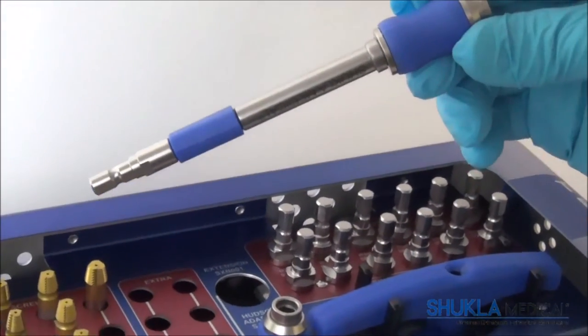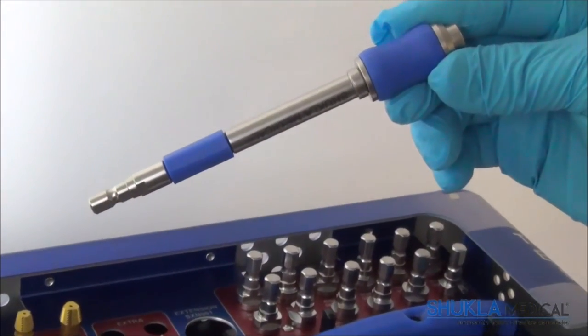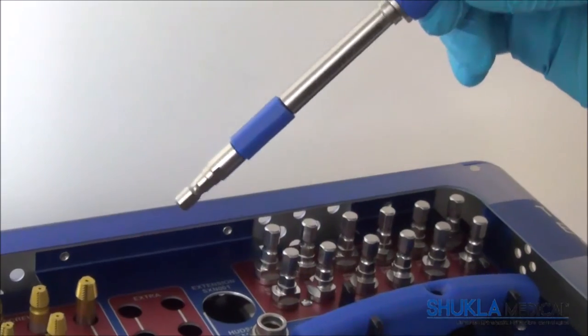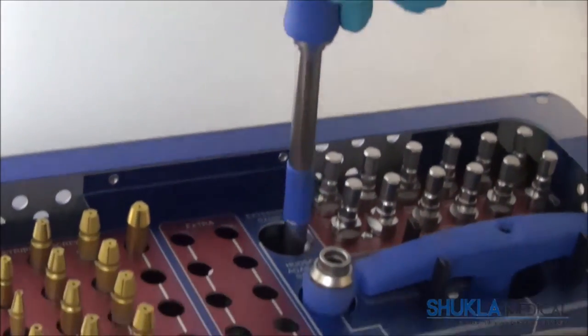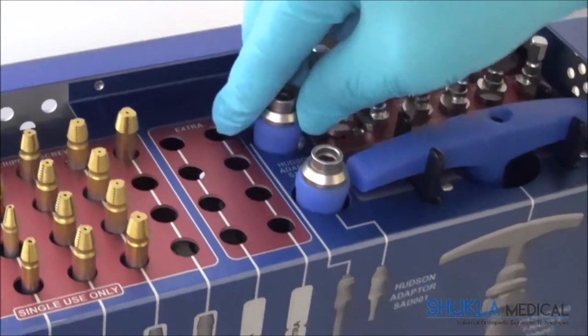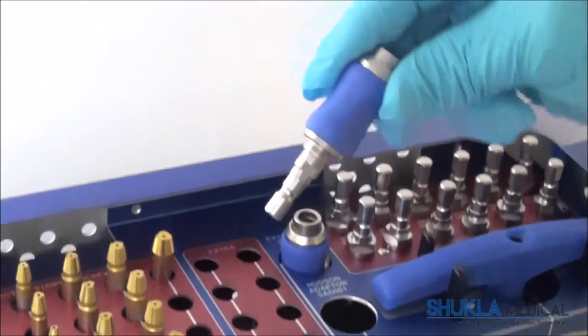To the right of the stripped screw extractor rows sits an extension which can be used with either the broken or the stripped screw extractors, and is ideal in cases where the screw is deeply embedded in the patient.